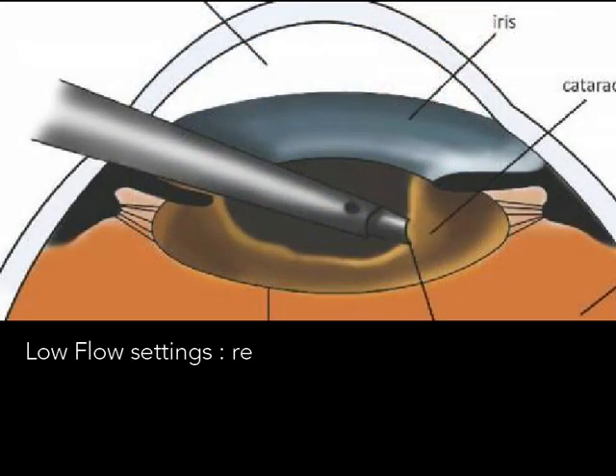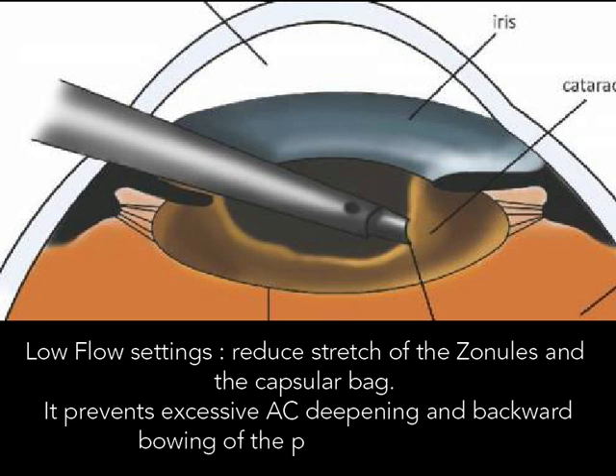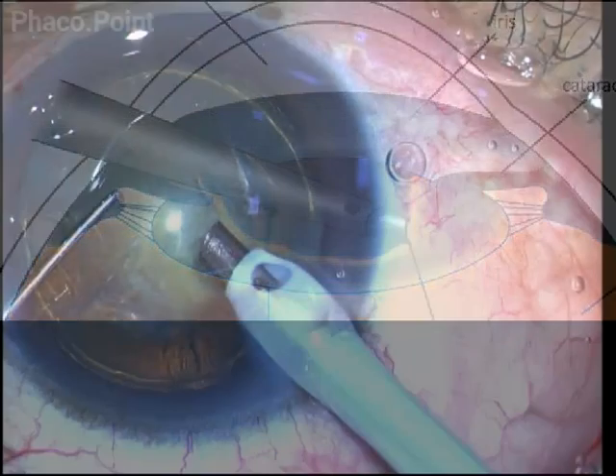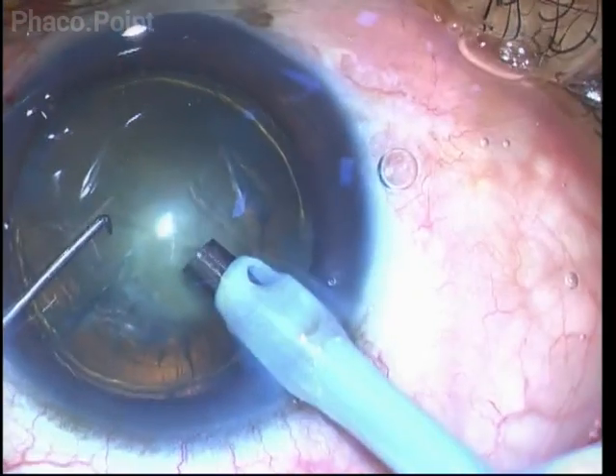The advantage of using low flow parameters while performing phacoemulsification is that it prevents stretching of the equator of the capsular bag. When the anterior chamber is insufflated with fluid, it will cause posterior bowing of the capsule as well, deepening of the anterior chamber, and this can compromise the already thin posterior capsule.